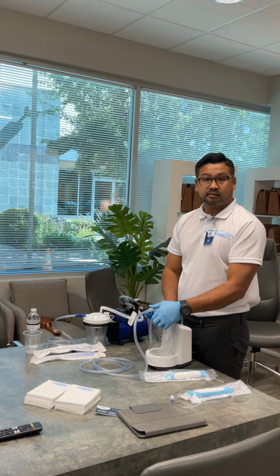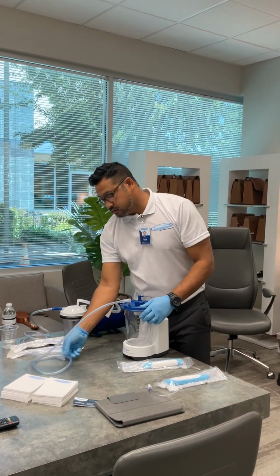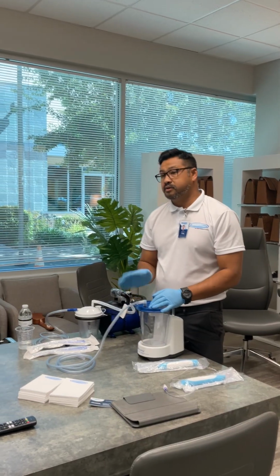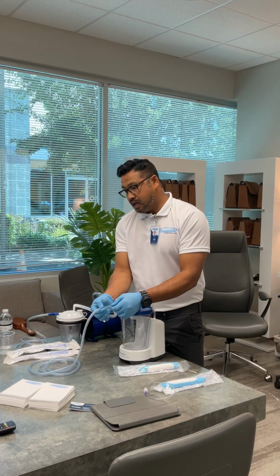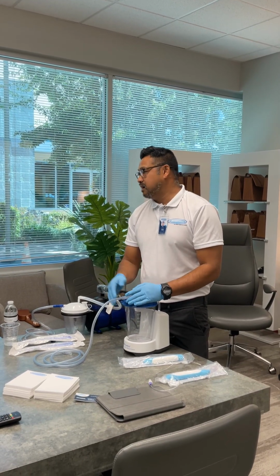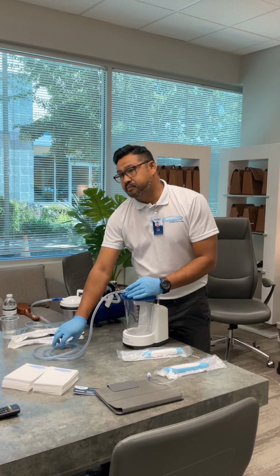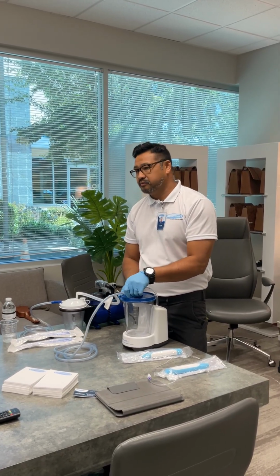Okay, questions about this? How often do you change the tubing? This tubing right here, so far, we just sent out the one. It's up to you guys if you think it's getting kind of crusty, but it is a really big diameter, and I don't think there's going to be a lot of buildup in there, because it's pretty big. But it's up to you guys. If you think it's getting pretty gnarly, just give us a holler. Soak in water. Yeah, rinse it out.